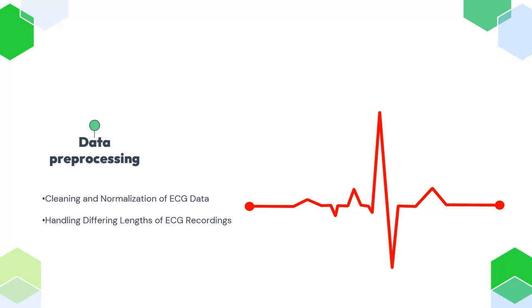We also had to address the challenge of differing lengths in ECG recordings as the duration varied from 9 seconds to over 60 seconds. To handle this, we standardized the input lengths by padding shorter sequences and truncating longer ones, ensuring uniform input to our models.